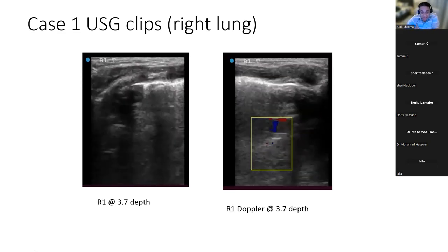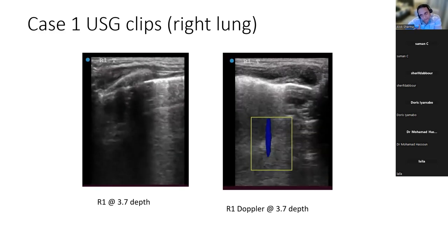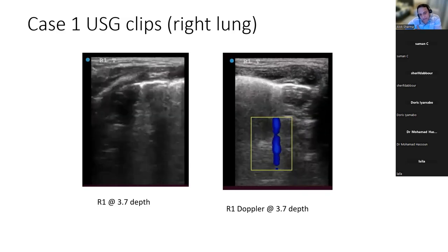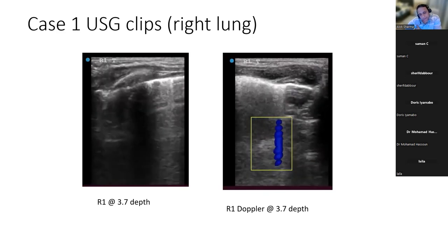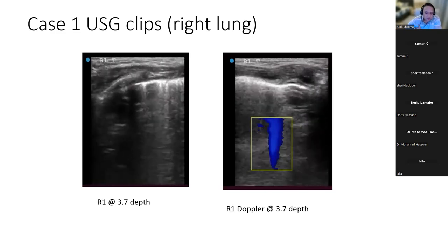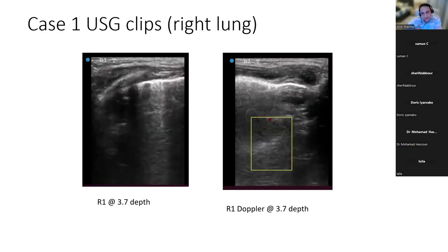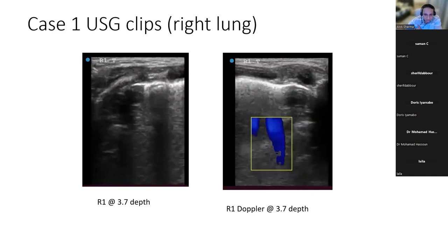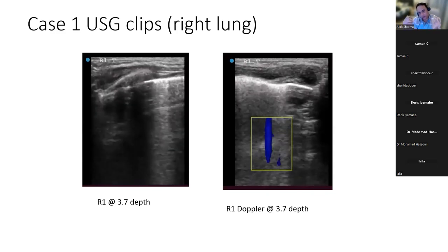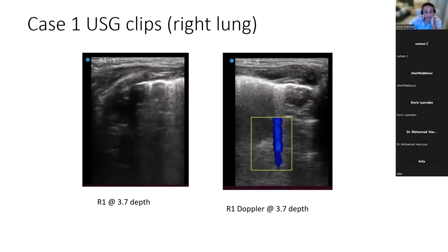It looks very vascular to me. You've definitely got some very big vessels there. What's the CRP on this baby? This baby had a high CRP, I think about 64. But it may not be at the same time that I did the ultrasound. It's very vascular, so it would fit more with consolidation. If there was complete atelectasis in that region, then you would not have any aeration. Theoretically, if you have atelectasis, blood flow to that region is also reduced. So that goes in favor of consolidation.